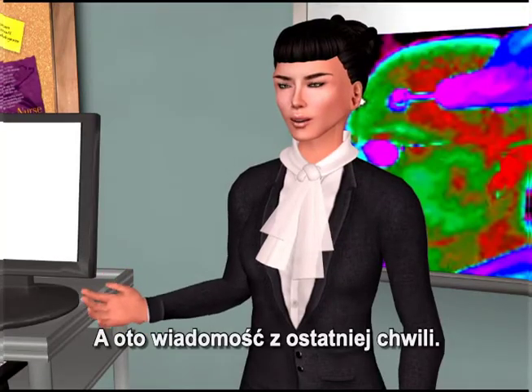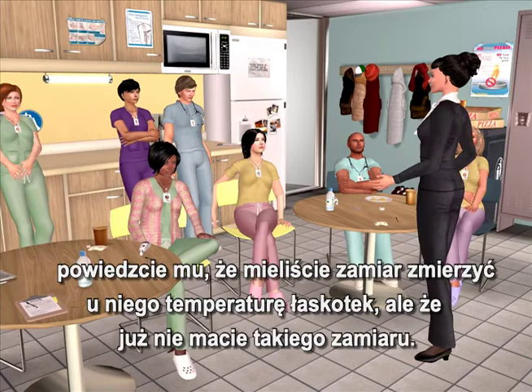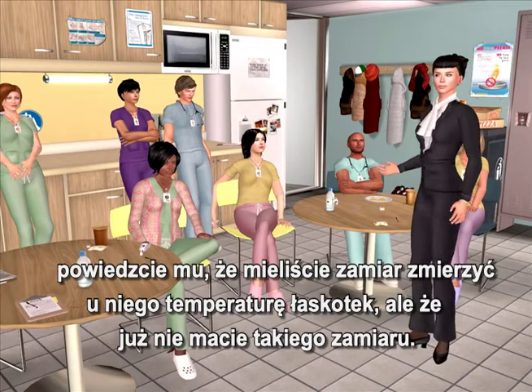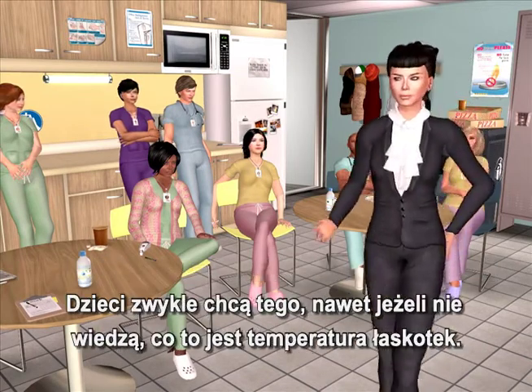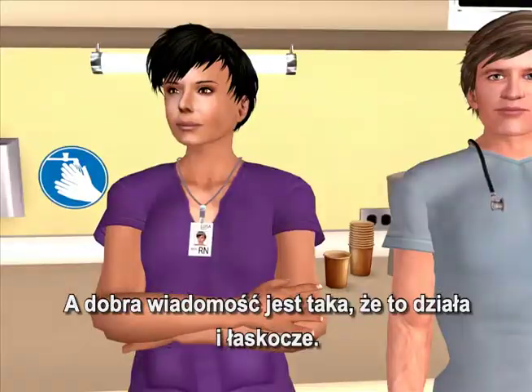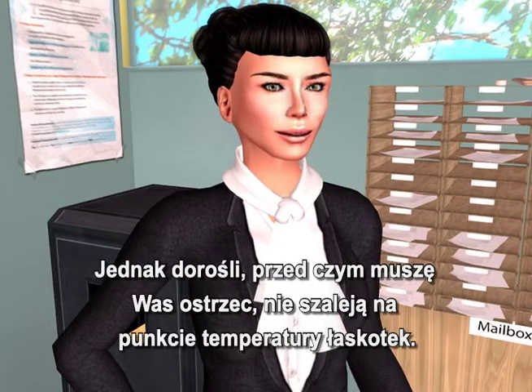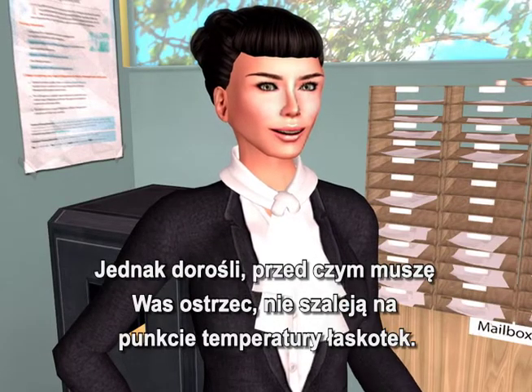Here's a newsflash: if you've got a fractious child, tell them you're going to take a tickle temp. Usually the kids, even if they don't know what a tickle temp is, will want it. The good news is it works and it does tickle. Adults, though — I'll warn you — aren't wild about a tickle temp.